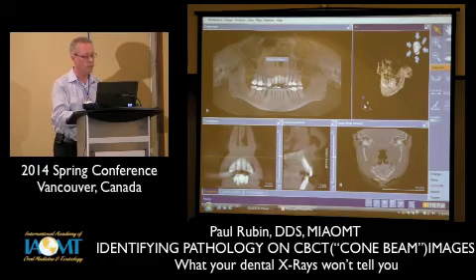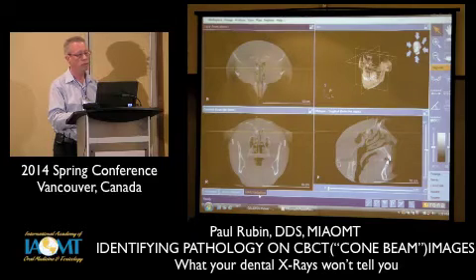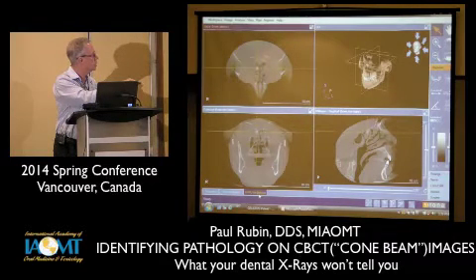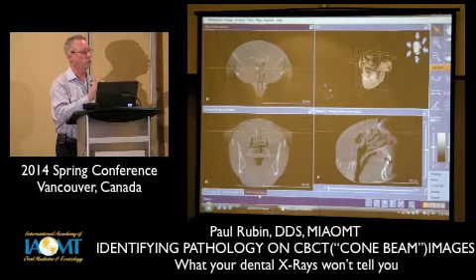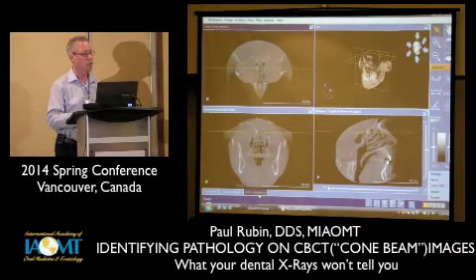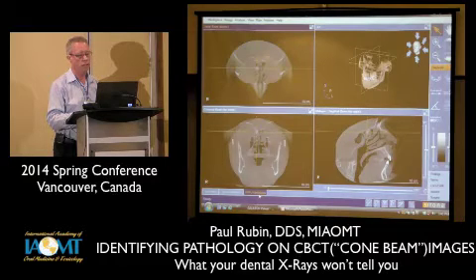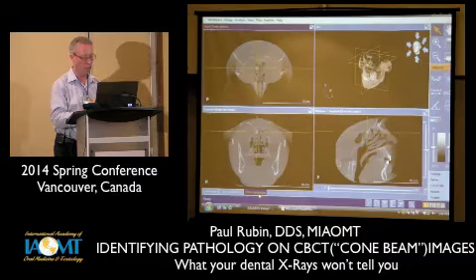There's another mode to this. This is called the panorama mode. If we click on the radiology mode, you're going to see some different kinds of views. Look on the upper right hand, and you'll see 3 planes. You can scan this image in all 3 of those planes and basically look at different slices. Upper left, you're seeing an axial slice as if you're looking from above. Lower left, you're seeing a coronal view as if looking from the front. And on the lower right-hand side, you're looking at a sagittal view as if looking from the patient's right. So this is basically what an image looks like.